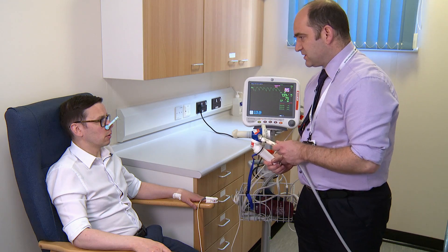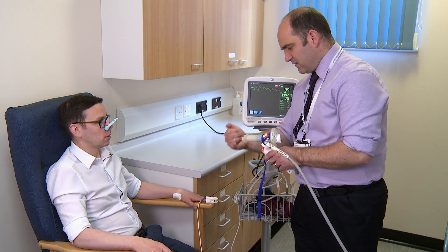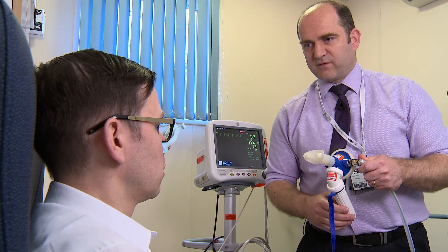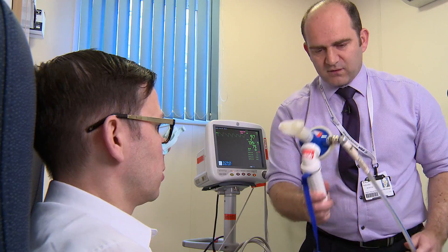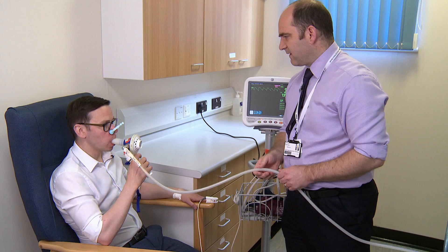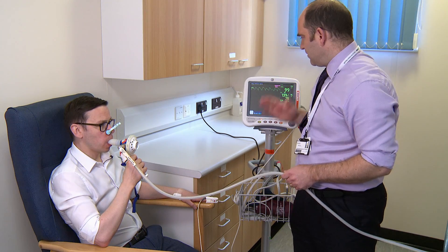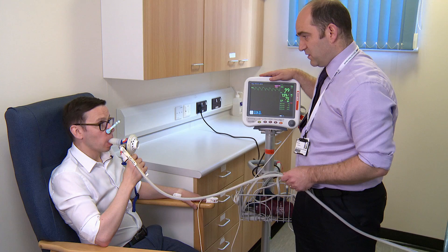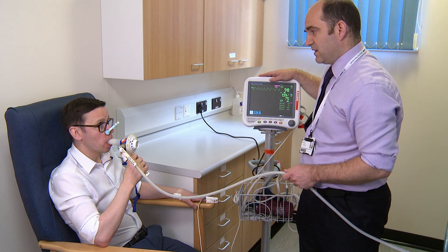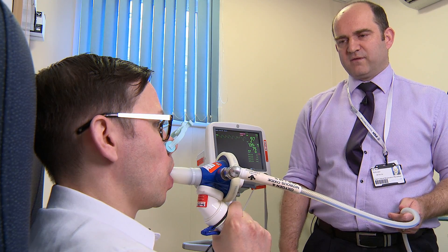So this is the device I'm going to ask you to breathe through. As you can see, it's like a diver's mouthpiece. You need to get those two edges into the corners of your mouth and you need to bite on the two prongs at the front there. Is that okay? Yeah. So if you hold onto the handle, pop your mouth onto the tube, lips tight, neck and shoulders relaxed, just keep breathing away. So I'm going to be monitoring your oxygen levels while you're doing that, and if there's anything we need to stop the test for, I'll come and let you know. You'll be on there for a maximum of 20 minutes.